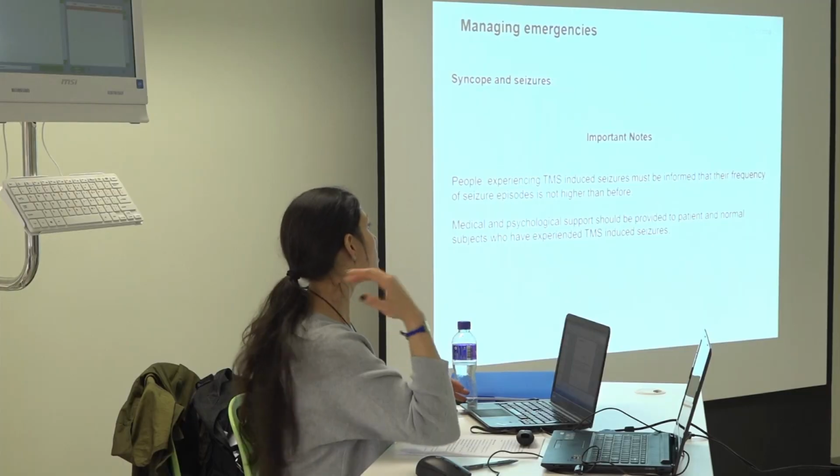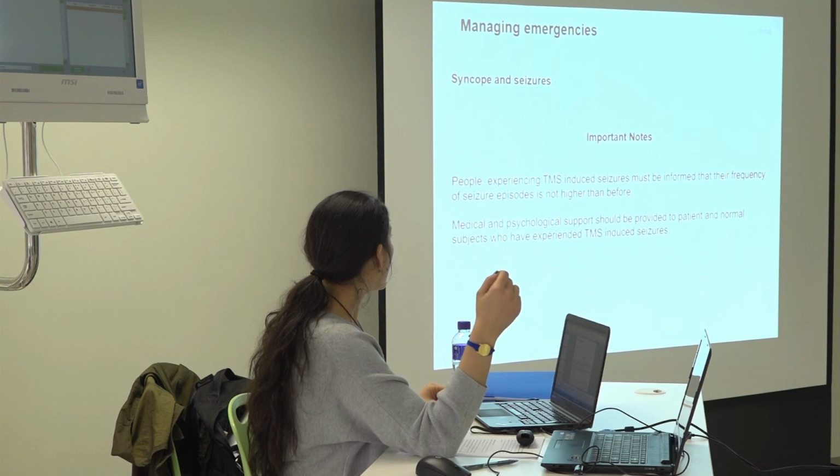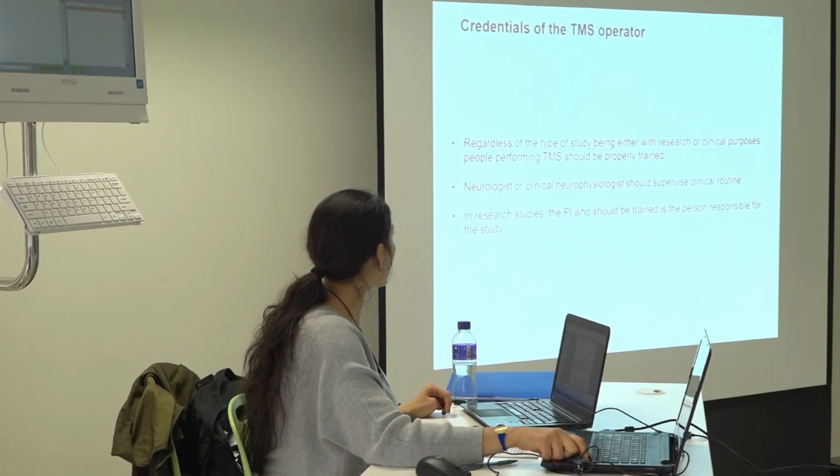What I already said, an important note, is that people experiencing TMS-induced seizures must be informed that the frequency of seizure episodes will not be higher than before. Medical and psychological support should be provided to patients and normal subjects who experience TMS seizures because it's really impressive, so you want to do that.